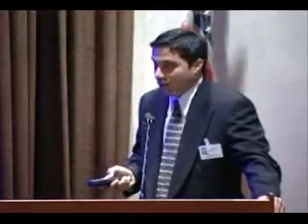So people who have arrhythmias like atrial fibrillation and other things might not be ideal candidates. People who have advanced congestive heart failure or severe aortic stenosis might not be appropriate for this study because of their higher risk. Now, like I said before, to decrease the heart rate and be able to take adequate images, we sometimes inject the beta blocker intravenously, or we just give it orally.